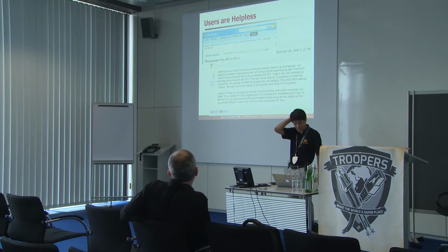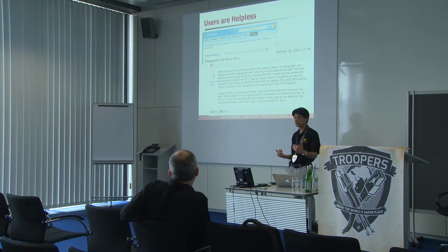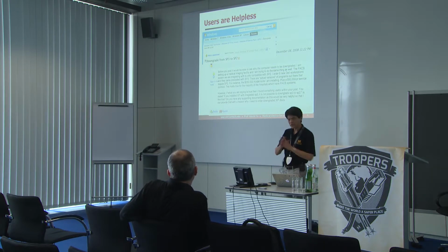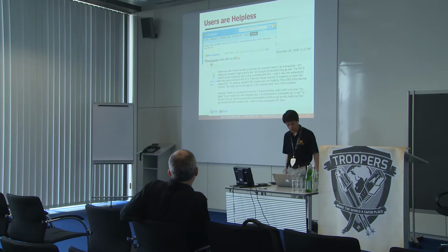Now, here's another issue, though. Users are kind of helpless. By user, I mean providers, hospitals, people in hospitals, because at the end of the day, they need to treat patients, and they need to procure systems to treat patients. Doesn't matter if they're safe, doesn't matter if they're secure, they need to treat patients. So imagine if you're told, well, you just invested $250,000 in a PAC system, which we learned was a picture archiving communication system, but it needs to run on an old version of Windows XP. What do you do? You downgrade, right?